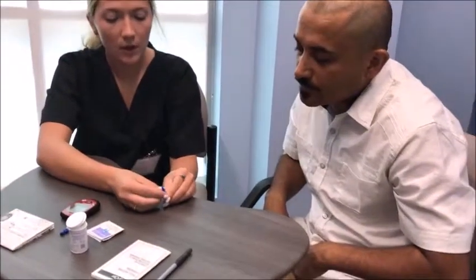With lancets, you're going to want to unscrew this one. There are also things called lancing devices where you can put the lancet in, and you won't have to do the sticking. You can just place it on your finger and click a button, which is a little faster and easier. With these, always try to prick your fingers, and you can do it on any finger. It doesn't matter.